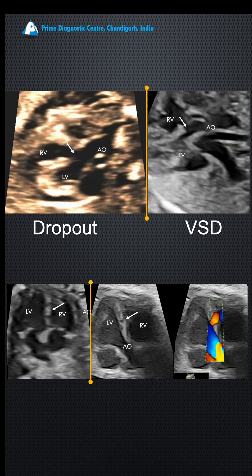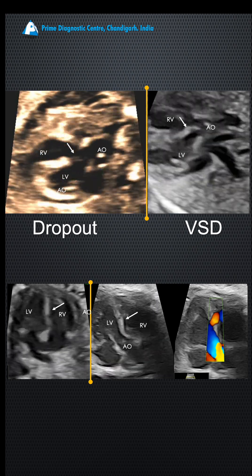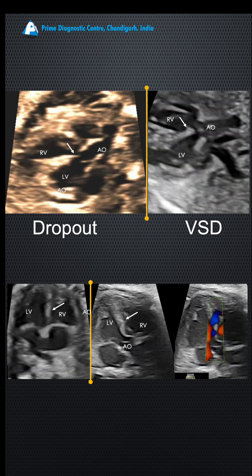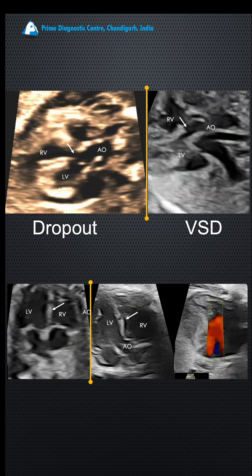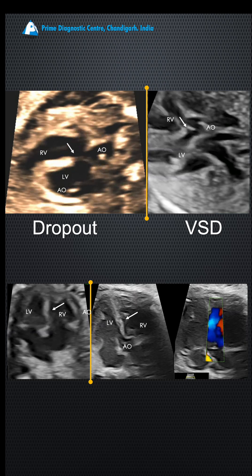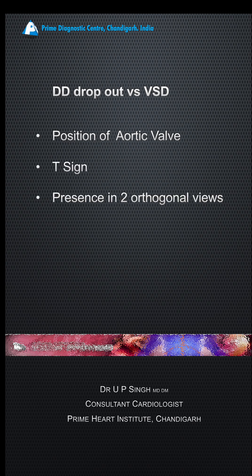In the lower panel you see a couple of dropouts, and on the second video there is another dropout — but color Doppler differentiates them. Color flow indicates this is a VSD; no color flow indicates no VSD. The VSD has to be inferior to the aortic valve — the T-sign — and should be present in two orthogonal planes using color Doppler, which I will discuss in my next segment.